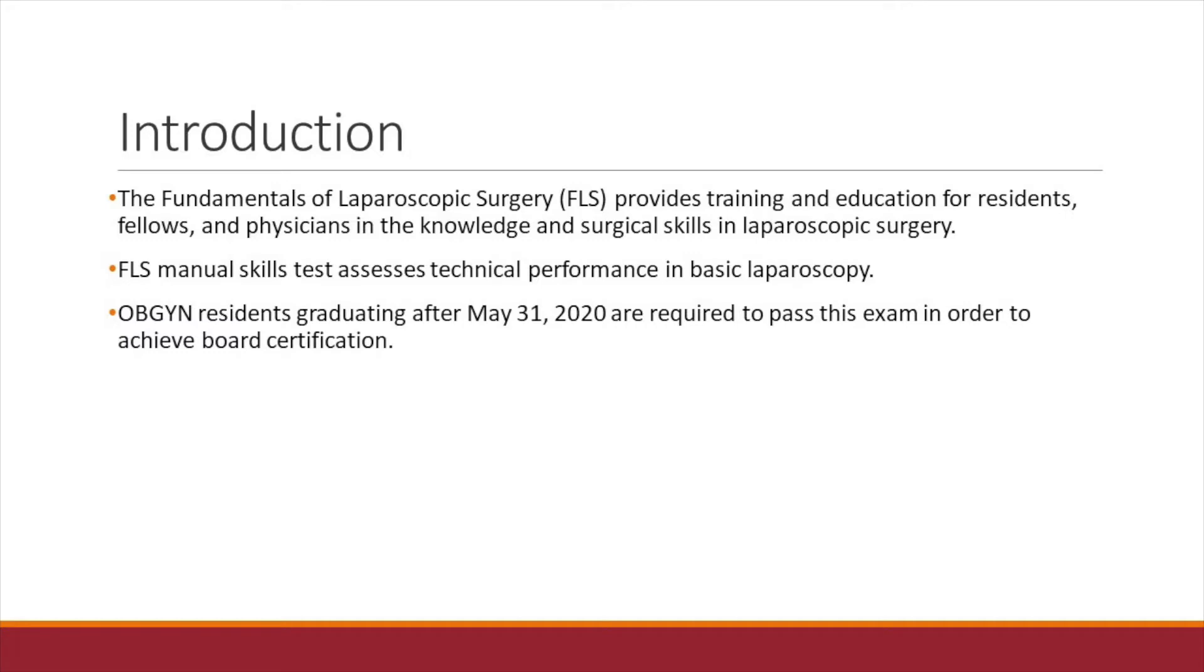In this video, we present our tips and tricks for the five technical tasks of the FLS manual skills exam.